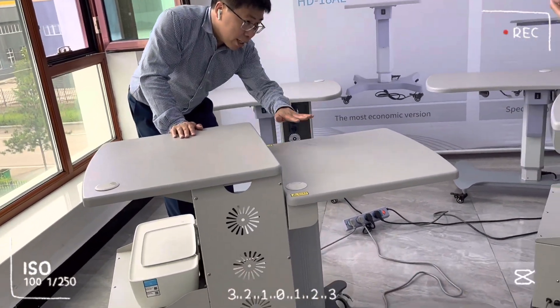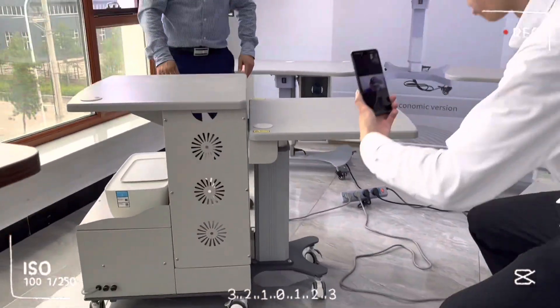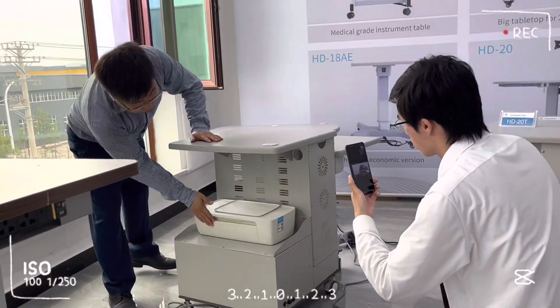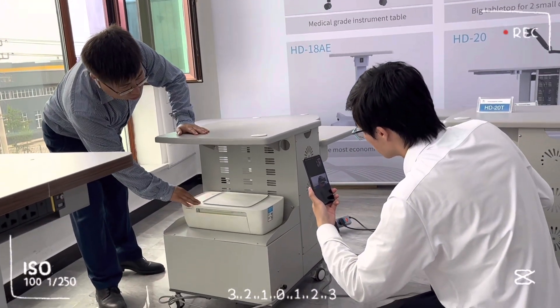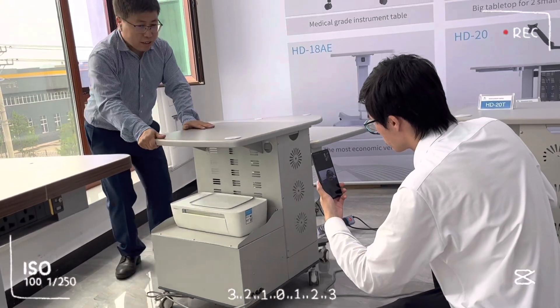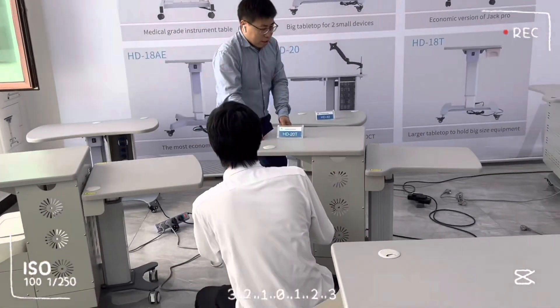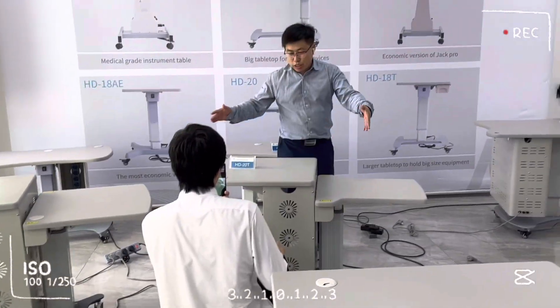This is the minimum height. You can put the printer over here, and then the OCT. So this is about the FHD20T.